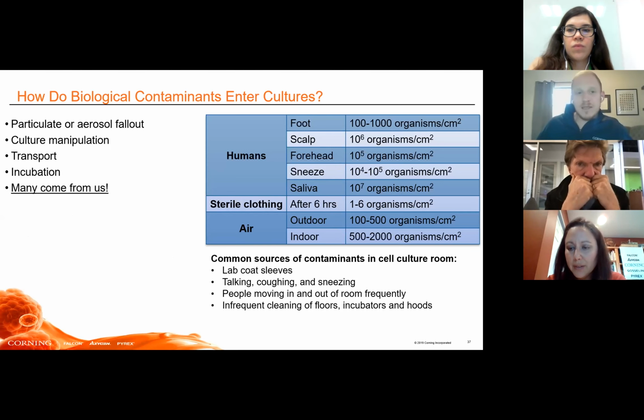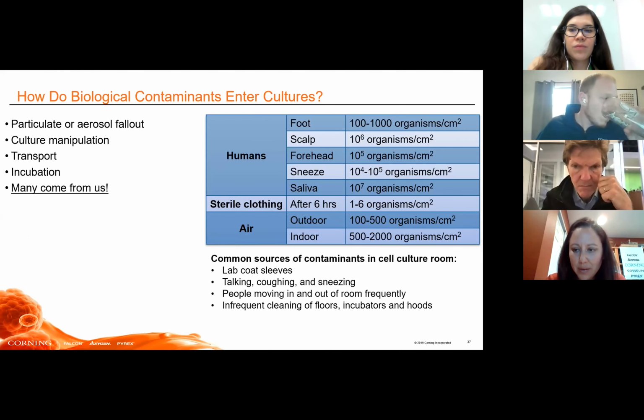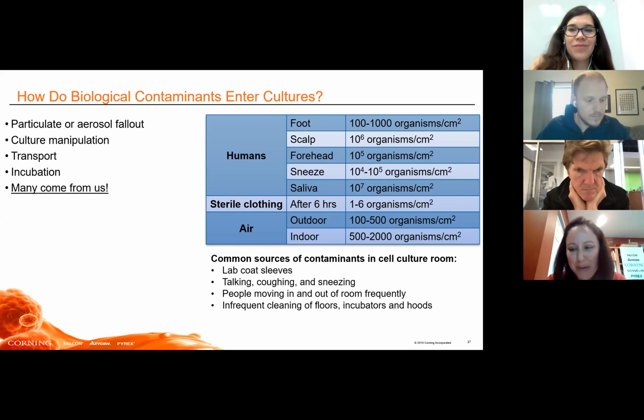Can I chime in, Austin? Yes. This is Bettina. I just wanted to comment that I believe MBC is using Corning media in many cases, that we do routinely screen for Mycoplasma, which just takes out one more thing to look for. So I just wanted to state that before you move on to the next topic. Thank you.